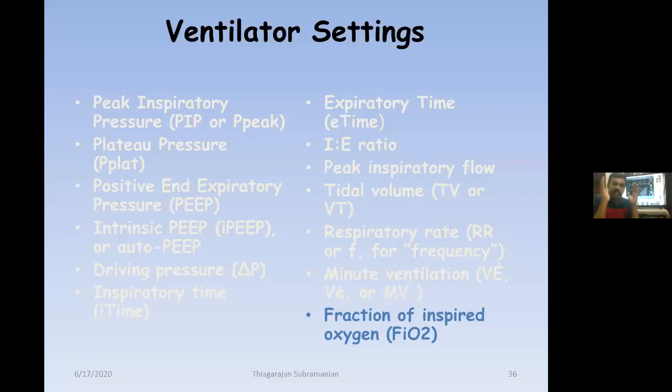If the graph shows a sawtooth appearance, there is a chance of lung secretions. You may say, sir, I can auscultate my patient and find it. Yes, it can be done. But sometimes the ventilator tube itself may be dripping with water due to the humidifier, and that watery sound can be misinterpreted as crackles. In that situation, we need to check the scalar and loop graphs of the ventilator. That is the ultimate point: if you do manual techniques and want to find lung secretions, the sawtooth appearance on the ventilator is another indicator for the physiotherapist.